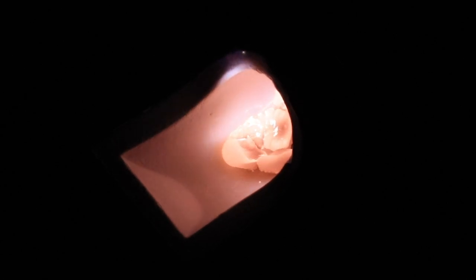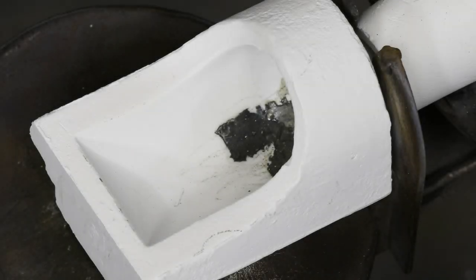Platinum Plus will slump like a cobalt chrome metal when it is ready to cast. It will not flow together as a typical noble alloy does. There will be a slight amount of slag in the crucible after casting that should be removed before reusing the crucible.